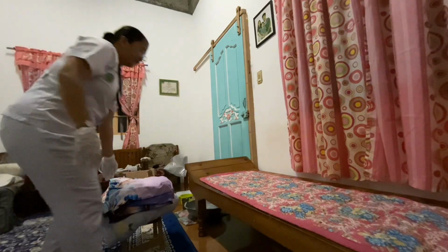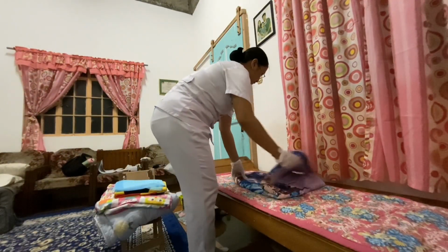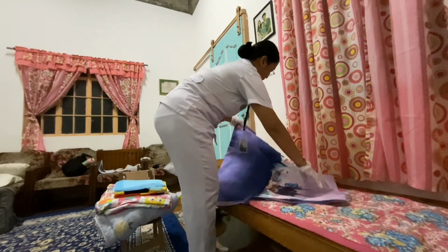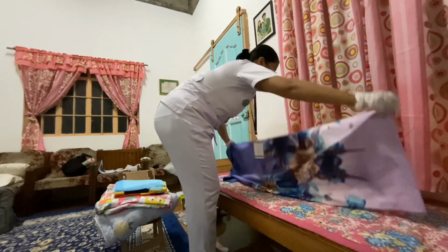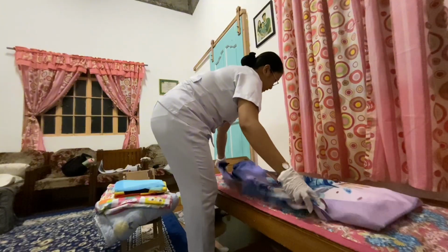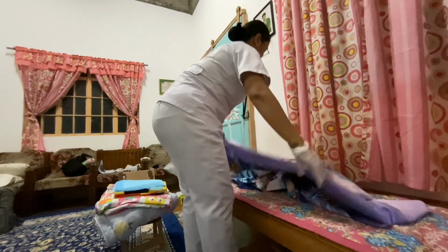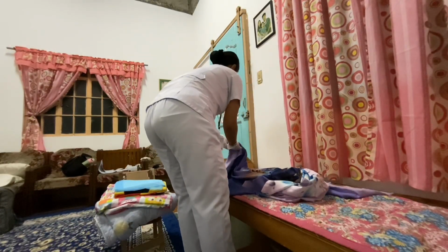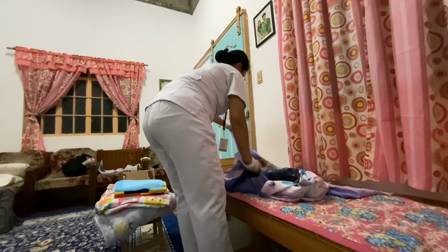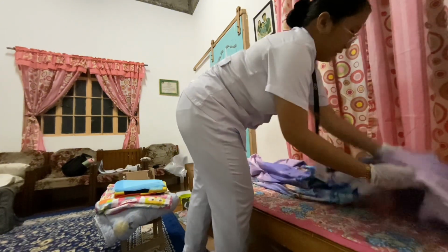Place a bottom sheet with its center fold in the center of the bed. I'm going to open the sheet and fan fold to the center. Opening linens on the bed reduces strain on the nurse's arms and diminishes the spread of microorganisms. Centering the sheet ensures sufficient coverage for both sides of the mattress. Nasa center fold po.